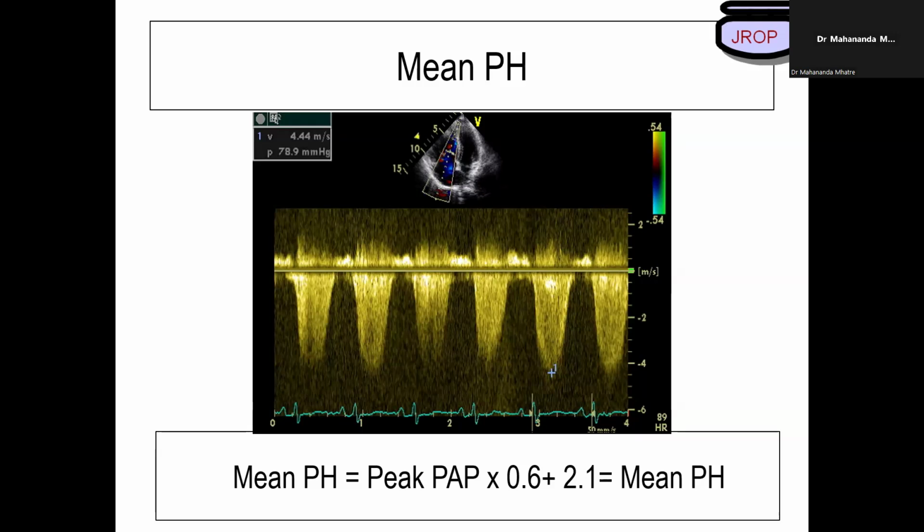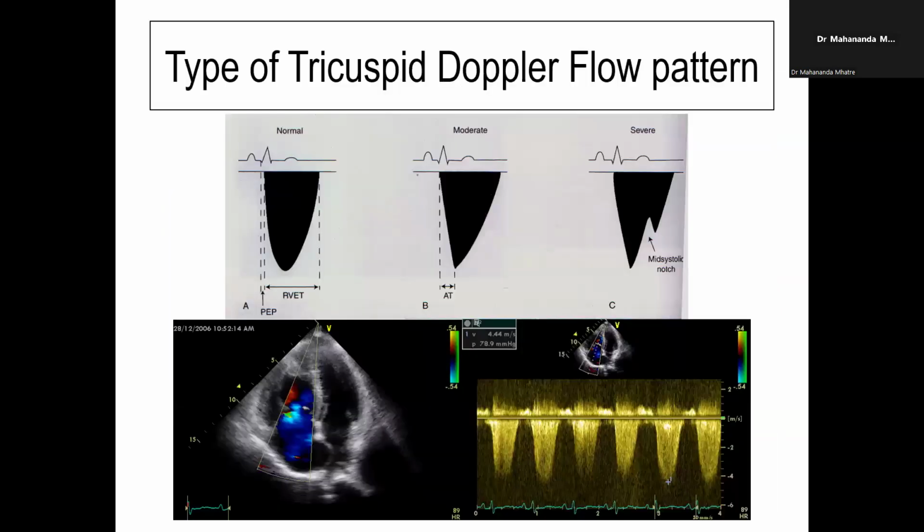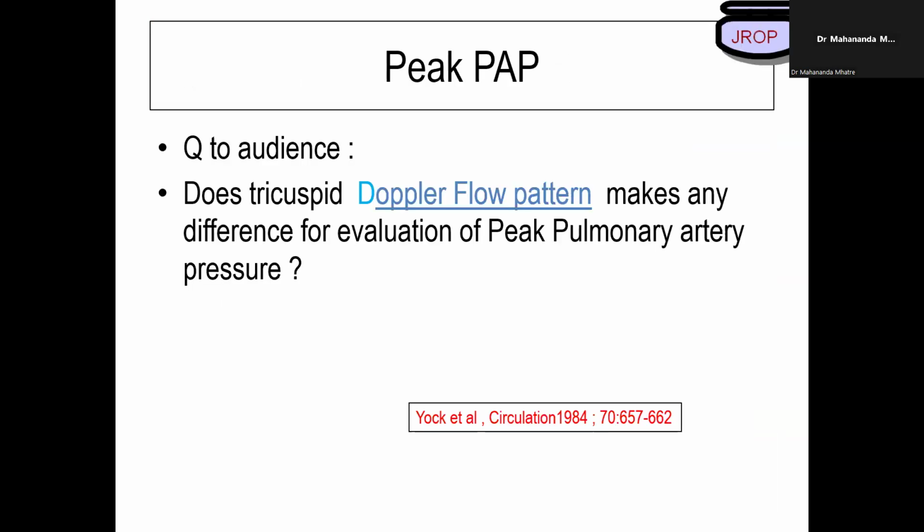Starting from the parasternal long axis, we go to the RV inflow view, parasternal short axis view at the aorta, then we go to the 4-chamber, focused RV view, and subcostal view. Where severe TR is expected, I get it. But as you say, in every patient we should have a normal TR-jet, that I don't get. If you don't get a normal TR-jet in a normal subject, it means you are hungry. You don't want to look for a TR-jet.